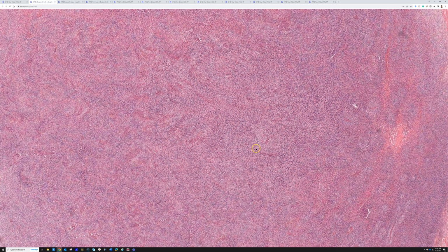Obviously, when we have the whole context that this is a large, deep mass, it doesn't make any sense really to be metastatic carcinoma. But if you had a small needle and didn't have radiographic information, that could make it much more challenging. So just recognize this pattern.